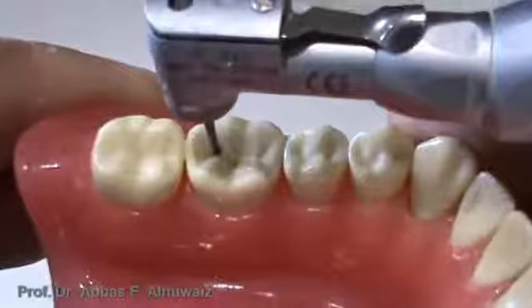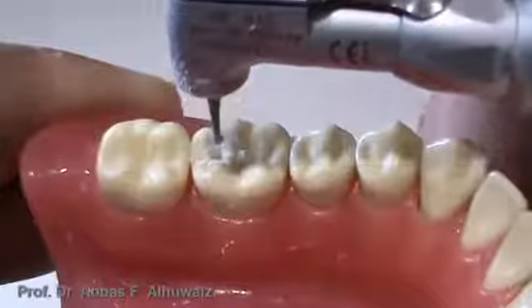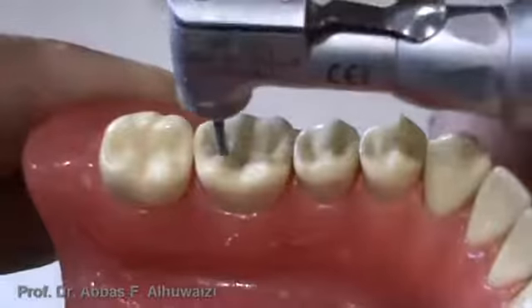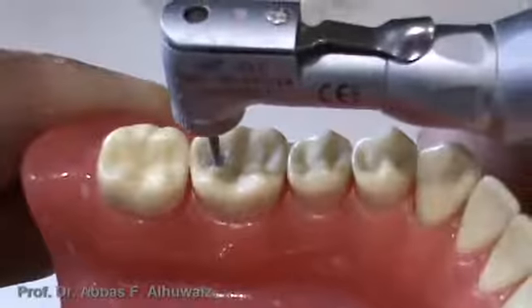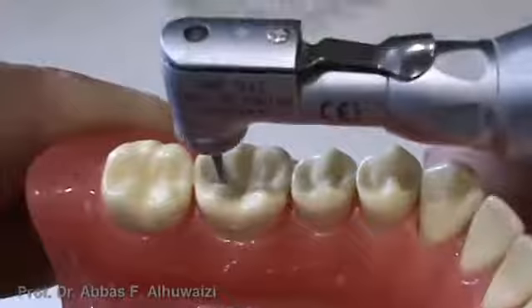We could also place other holes at the mesial and distal foci to establish a uniform depth.